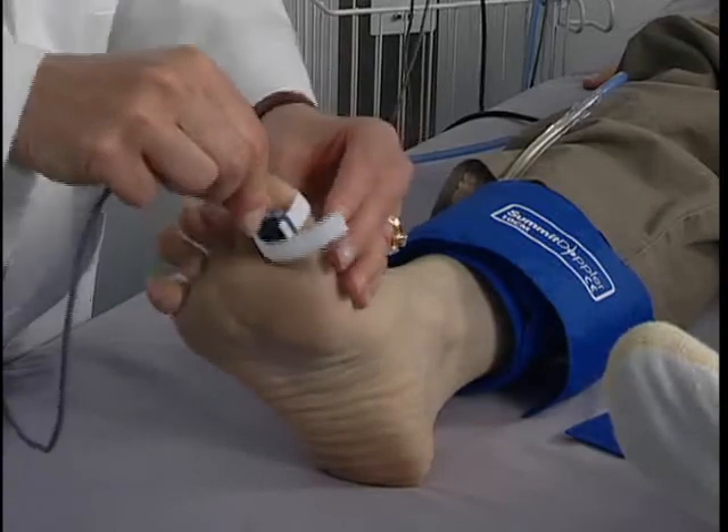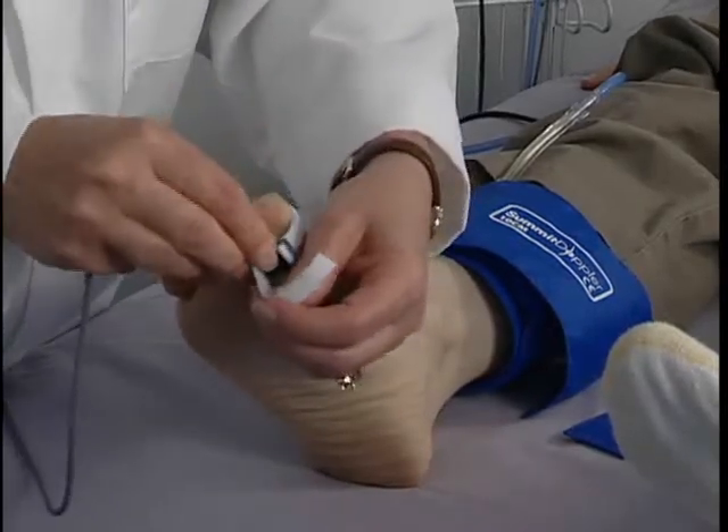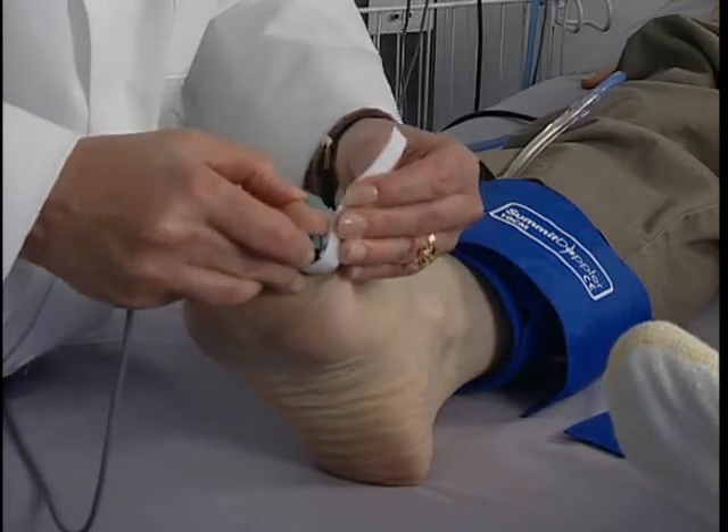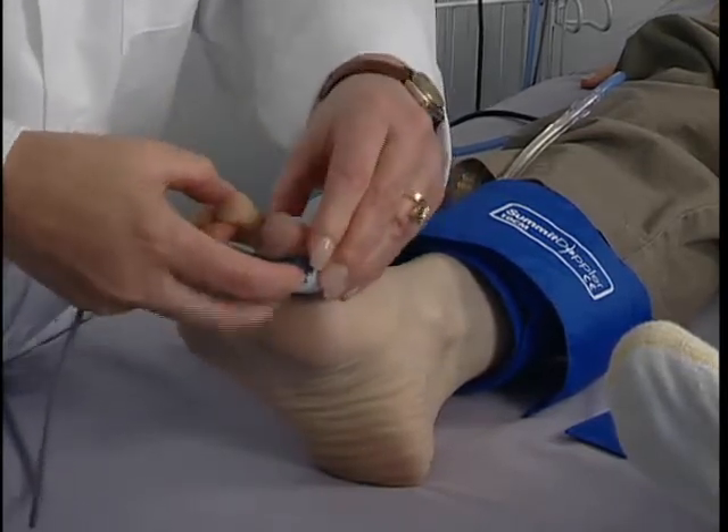Move the hose to the ankle cuff and move the PPG probe from the finger to the great toe. Again, attach the probe snugly but be careful not to occlude blood flow.